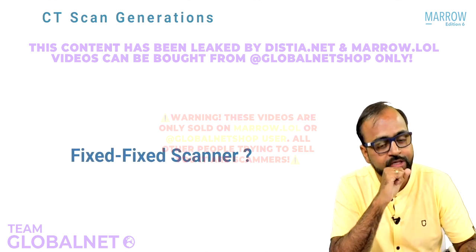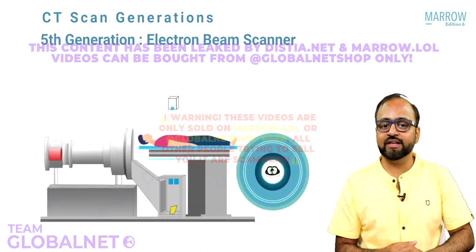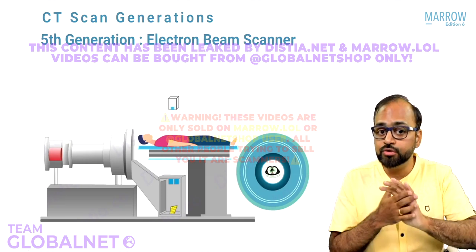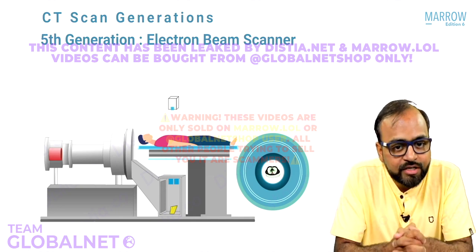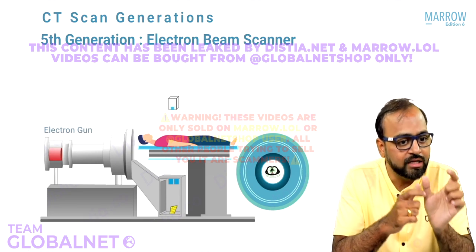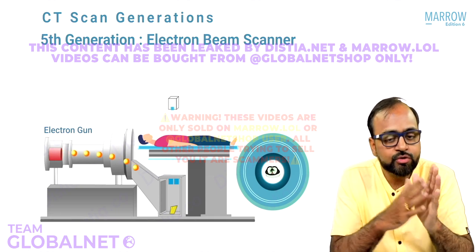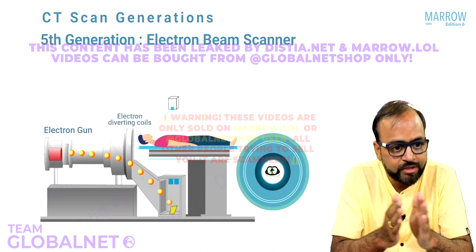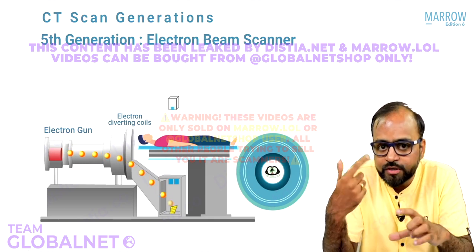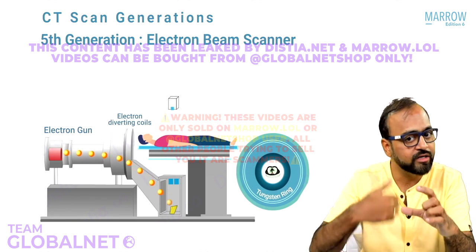Is it possible? Yes, nothing is impossible, remember. And scientists have actually come up with a fifth generation CT scanner, and that is what is called the electron beam scanner. There is not even a single moving part in this machine. See, what happens is that on one side of this particular machine, there is an electron gun or an electron emitter. This is going to emit a high velocity stream of electrons. It is going to pass through certain coils, which are going to be the electron directing or deflecting coils. Now around the patient's body, everywhere around the patient's body, 360 degrees, there is a ring of tungsten. So there is a tungsten target ring which is placed.